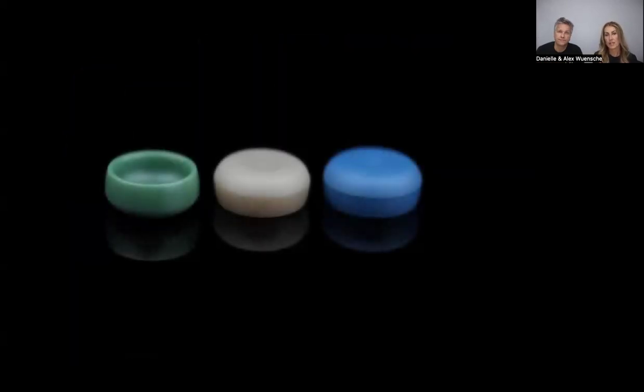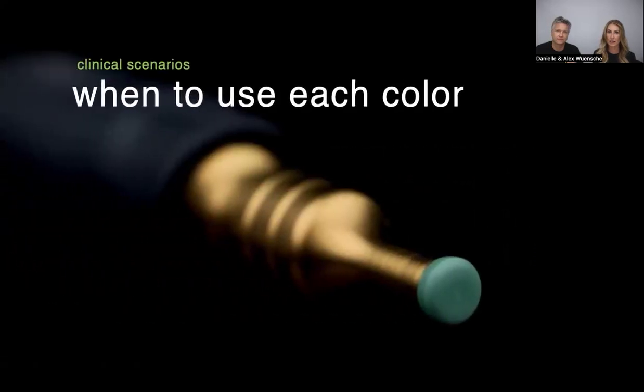And here you have basically different colors of the nylon inserts, and the retention varies from the lightest to the hardest. I would say always start with the lightest retentive nylon insert, because a good friend of mine, a great dentist in New England, finished this Locator overdenture case. He went to put it in the patient's mouth. He used very, very tight nylon inserts, and he's calling me at the end of the day. It was like 5:30, and he's like, Veronica, I could not get the denture out of the patient's mouth. I had to cut it. So this is also very important. Use the lightest nylon inserts to start with, and then work your way up.